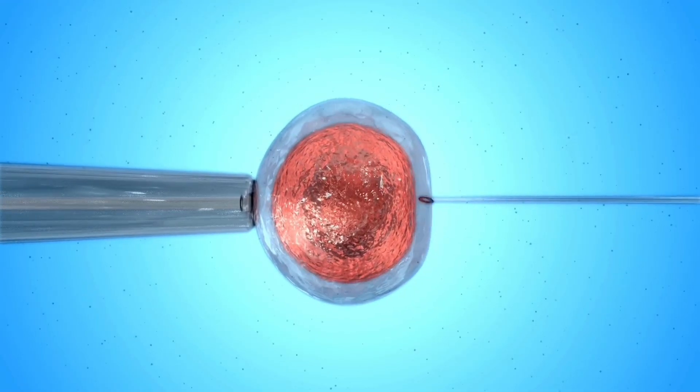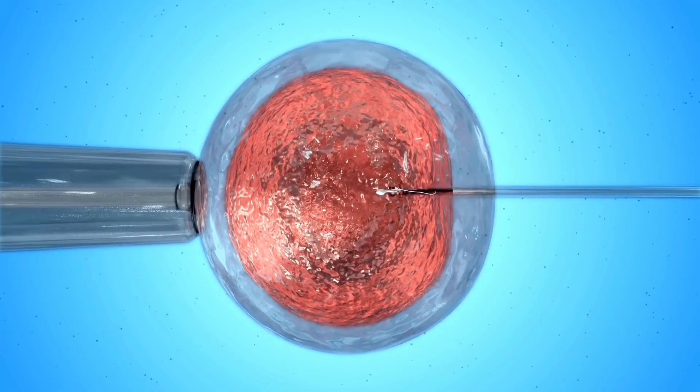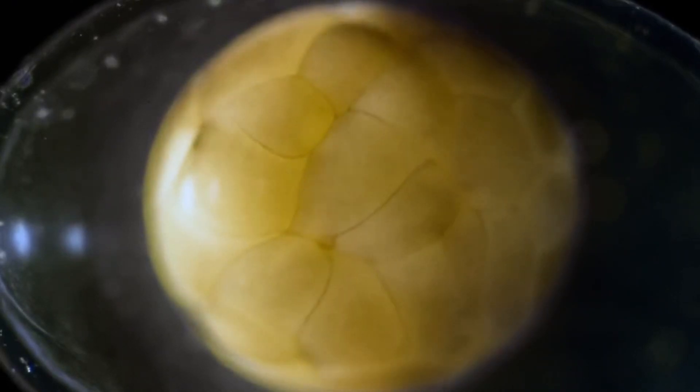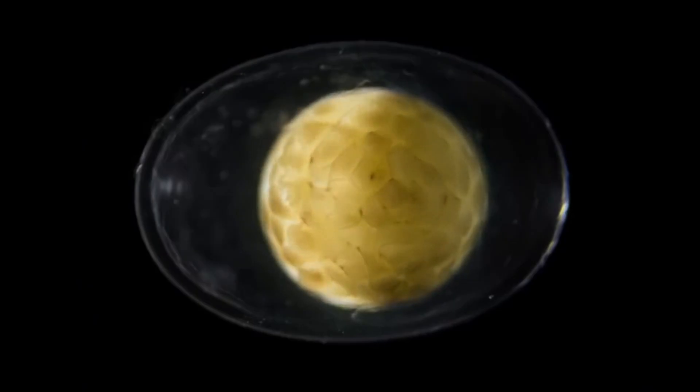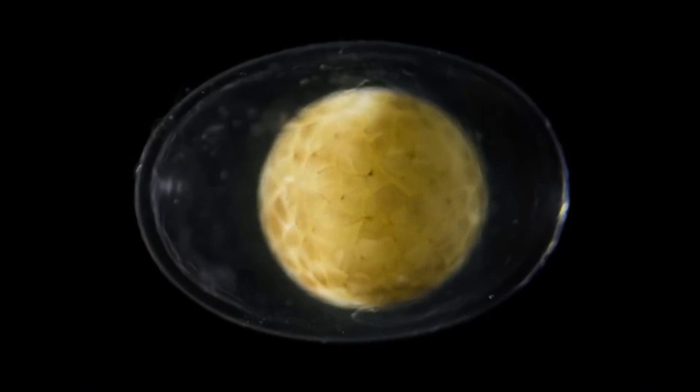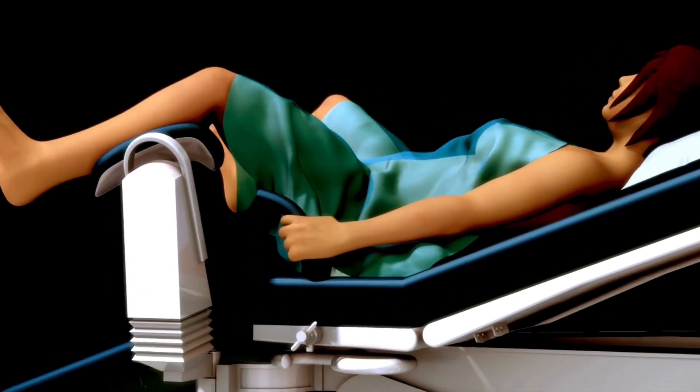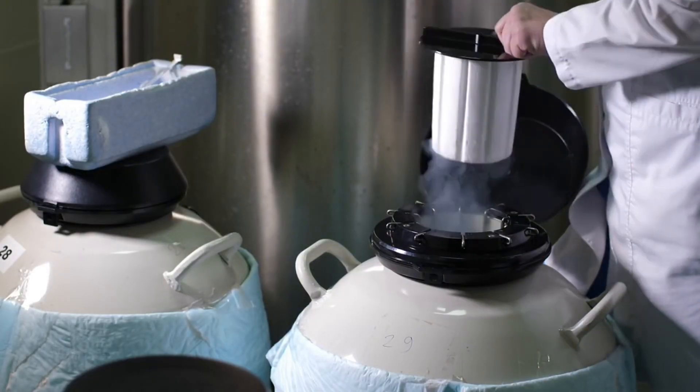The fertilized eggs, also called embryos, will be monitored for three to five days as they begin to grow. At this time, the lab may create a hole in the zona pellucida surrounding some of the embryos. This process, called assisted hatching, will help these embryos implant in the uterus. Some of the embryos will be used right away for embryo transfer, and the rest will be frozen and stored for future use if necessary.